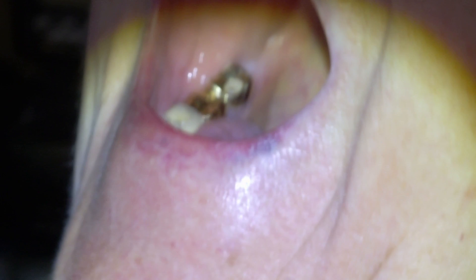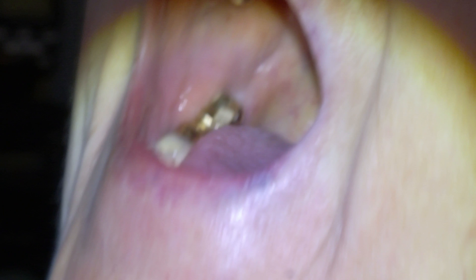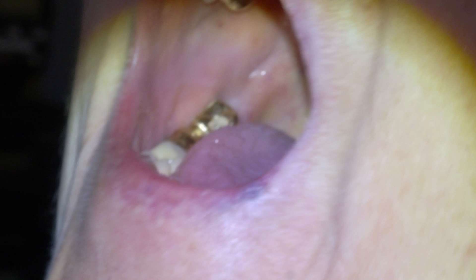You can look straight out the window, tip the chin up a touch, and open as wide as you possibly can. I'm going to make another video on how I actually position them in the chair so that I can have a consistent setup, which is probably one of the most important things. The landmarking is always going to be the same regardless of where you position them, but I'll show the chair setup in another video.